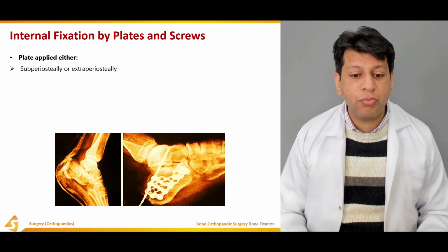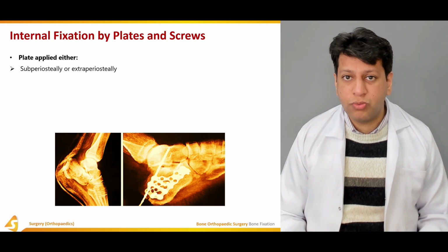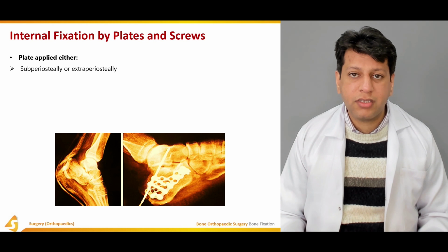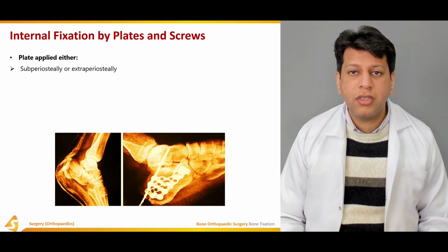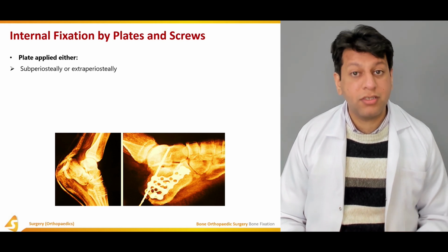the use of fluoroscopy, the screws can be placed and drilled through the holes which are made. Although this is comparatively tedious and takes a little more of a learning curve, overall it's very good for the bone because the vascular supply of the bone remains intact.